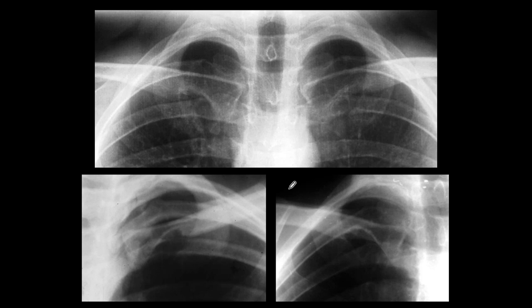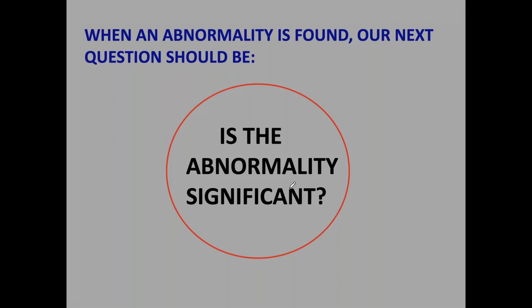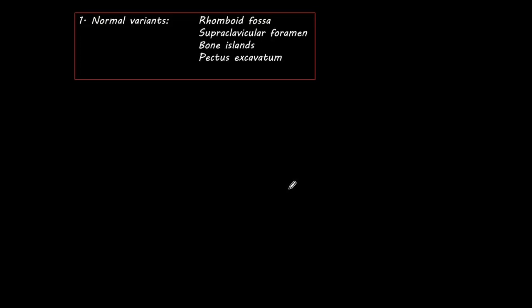The conditions that offer non-significant abnormalities are normal variants. They usually involve the skeleton of the chest. I mark here four of them — in my opinion, the more common: the rhomboid fossa that we already mentioned, the supraclavicular foramen, bone islands, and pectus excavatum. The supraclavicular foramen is a small orifice in the middle third of the clavicle, either right or left, and we'll see it better in the coned-down view.